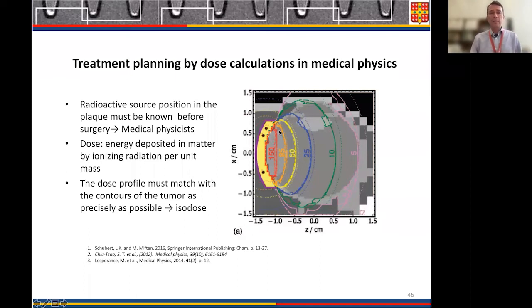One of the difficulties in episcleral plaque brachytherapy is that this ovoidal shape that represents the tumor is, in general, not a very clear ellipse. It can have the form of a mushroom, or a variety of shapes, and sometimes it is located very close to the optical nerve.